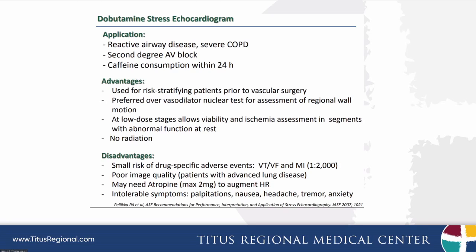The disadvantages are that the medication itself, dobutamine, can have some serious side effects. They're very small in terms of the incidence, but they do happen, and you have to be vigilant for this. And that's why someone with ACLS training needs to be watching these patients at all times during the procedure to make sure that if problems do develop, we can treat them promptly.